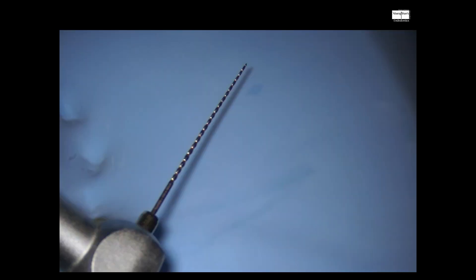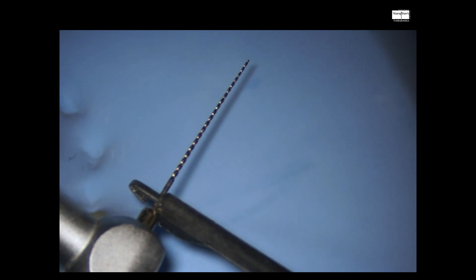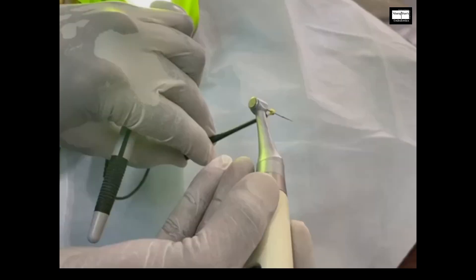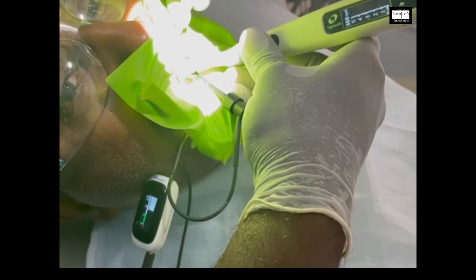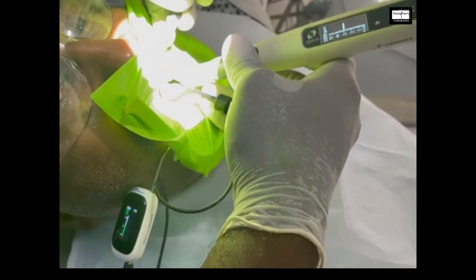This can be done in different ways. One way is with the same Apex Locator endomotor you already have in your clinic — you just attach the Apex Locator's file holder to the endomotor, that is the rotary file, and start using it. You attach the file holder to the rotary file, the lip clip contacts the oral mucosa, and both are integrated together.